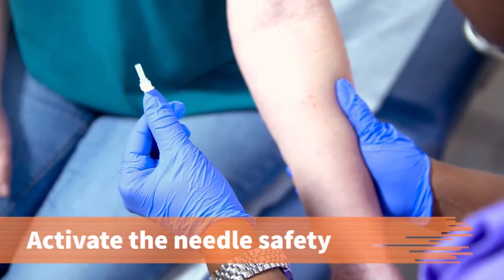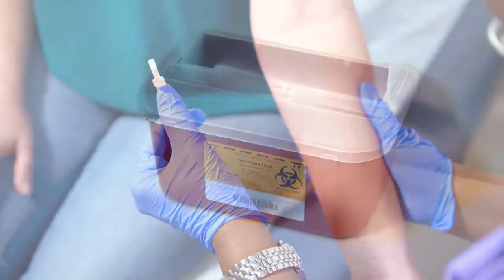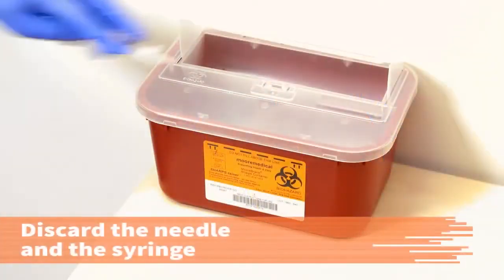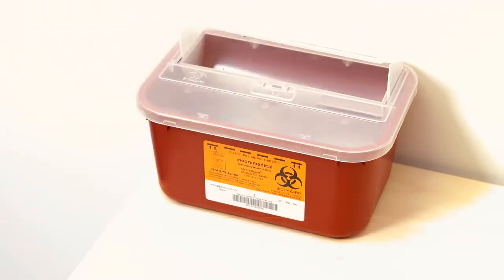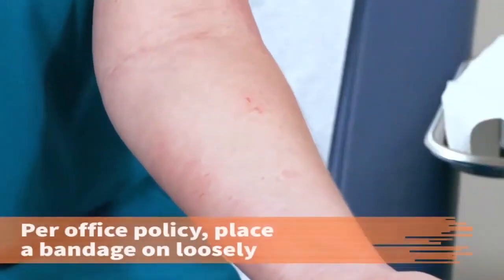Activate the needle's safety device with one hand. Discard the needle and syringe in a biohazard sharps container. Make sure to put the needle in first. Do not massage the area.